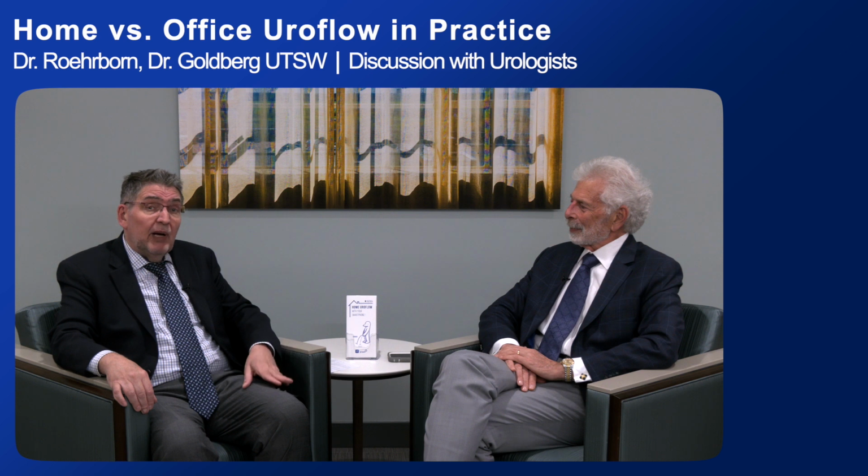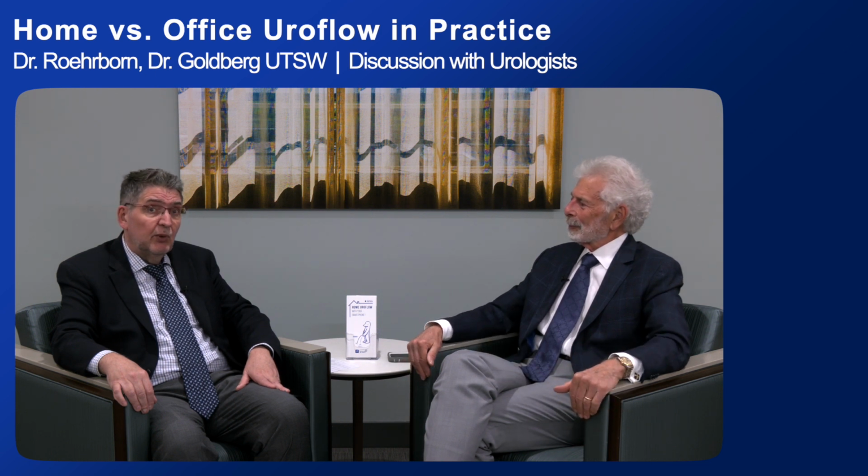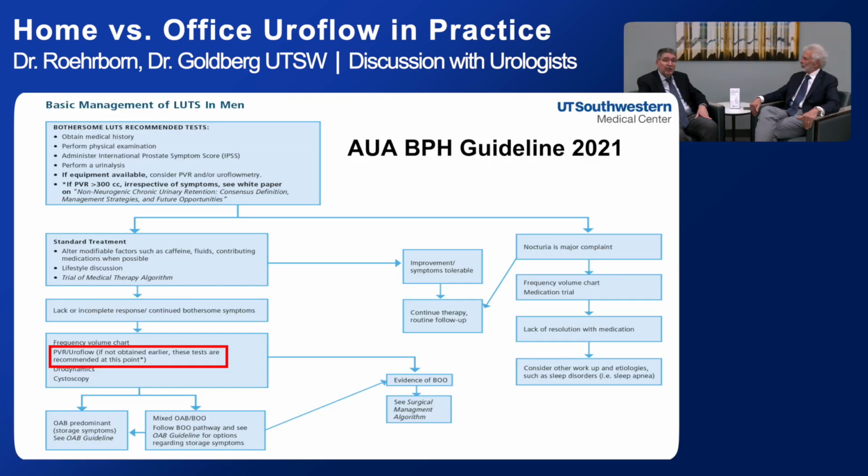Now, I have been all my academic life part of the AUA guideline process, and the AUA BPH guidelines recommend a flow rate recording in men with LUTS and BPH early on in the evaluation if the equipment is available. But even if it's not readily available, the guidelines admonish us to do a flow rate recording and residual urine check if we change treatment, if symptoms get worse, or if a patient is considering surgical treatment.